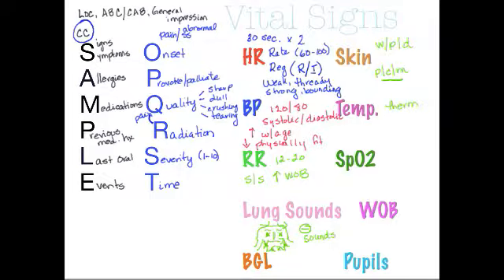And then we're going to use the pulse oximeter, and generally speaking, we're hoping for something greater than 95%, unless it's a chest pain patient, and then we're happy with 95%. 95% is okay. We don't need to bump them up to try and get them higher than that. But generally 95% or greater. So we'll say greater than or equal to 95% is what we're hoping to see as a normal finding. And we addressed the work of breathing already, so I had that in its own category. And so I don't need to address that again.